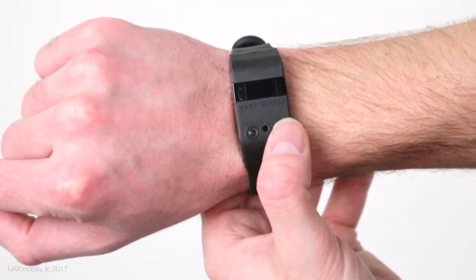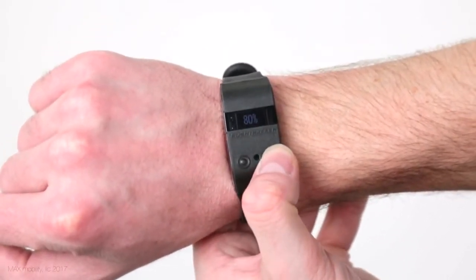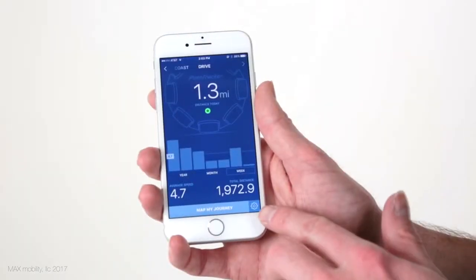The smart drive is designed to be intuitive and ready to use for almost everyone right out of the box. But if small tweaks need to be made, you can do it with the PushTracker and the app. Within the settings menu, the smart drive settings submenu is just for that, adjusting the way your smart drive works, which we will discuss in a bit.